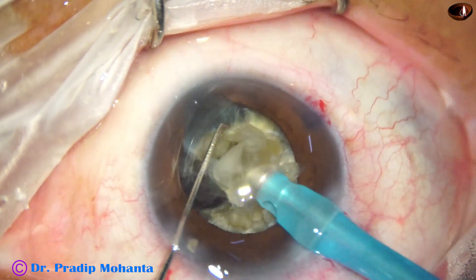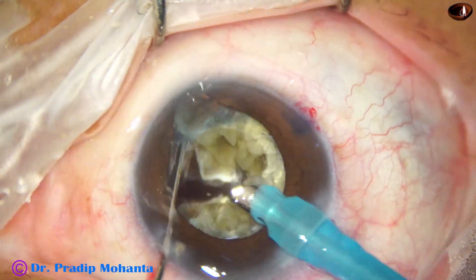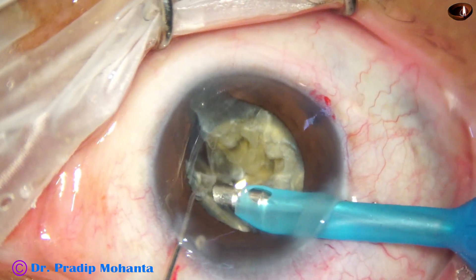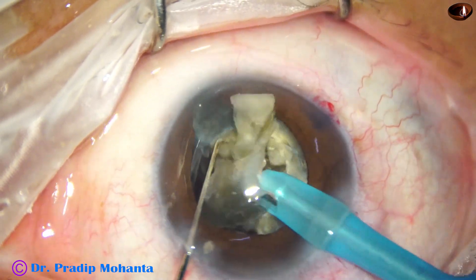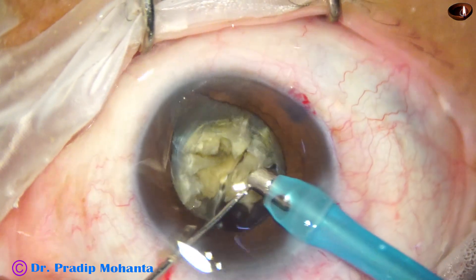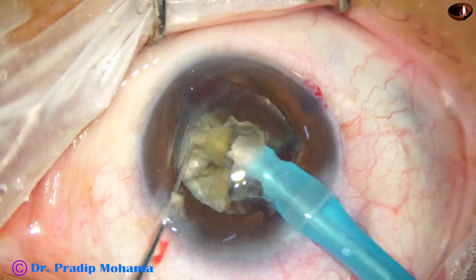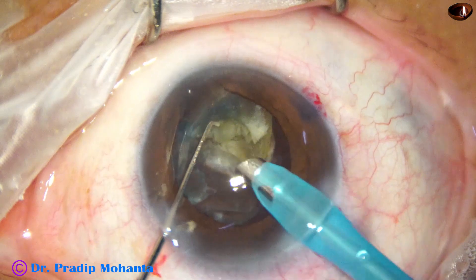I have got about five pieces. See what I am doing — I am keeping two pieces down all the time, and I am trying to hold the pieces which are near 12 o'clock, so that the two pieces downward support the colobomatous area. Two nuclear pieces are removed. My plan is to remove this piece next, then push one piece down to support the colobomatous area. Then finally, only one piece remains at the last.